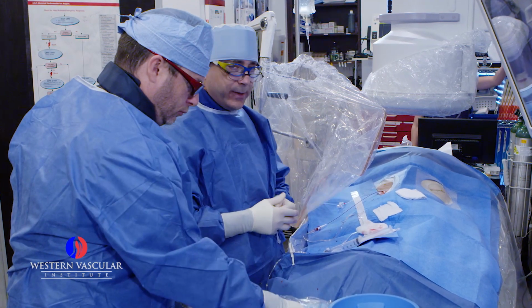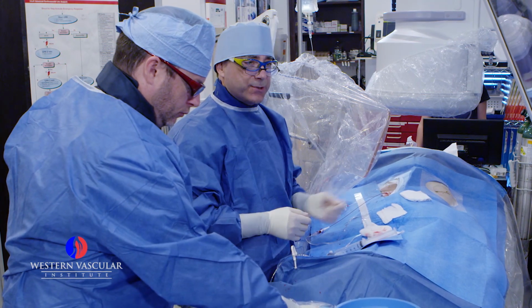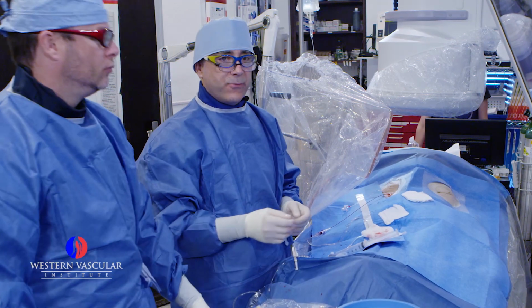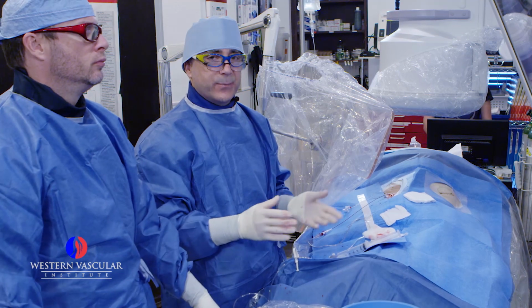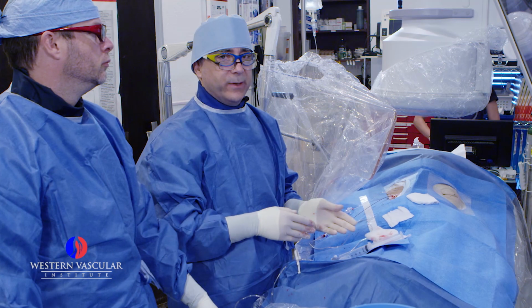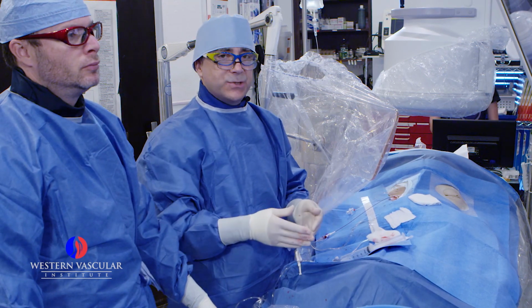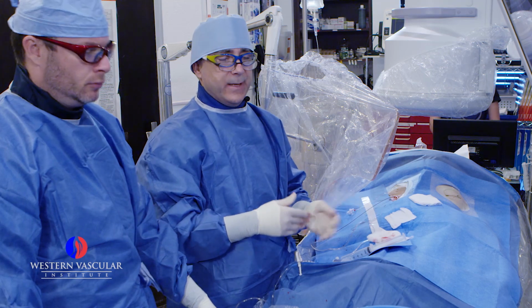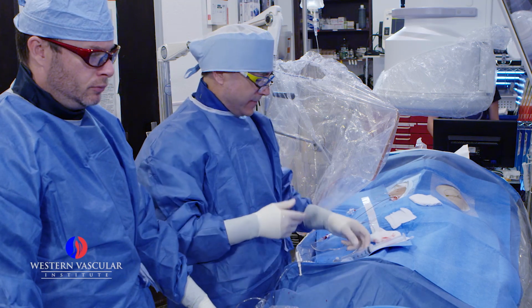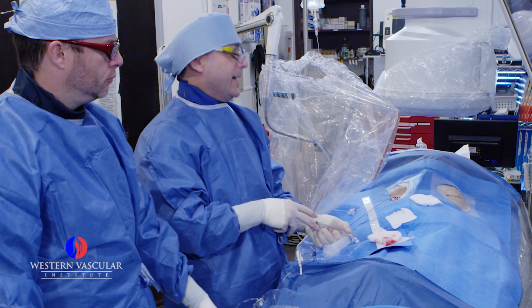And also we'll probably use ultrasound, which is called intravascular ultrasound, which is an ultrasound probe inside the artery looking out, which gives us a better perspective of how narrow an artery is and the location of the narrowings, and also can be used to try and determine whether the intervention that we do is adequate or maybe something additional needs to be done. So we're going to get started by doing what we call an abdominal aortogram with carbon dioxide.